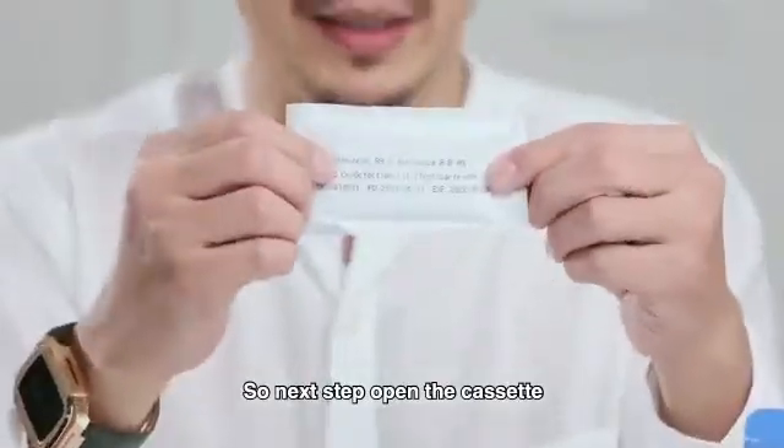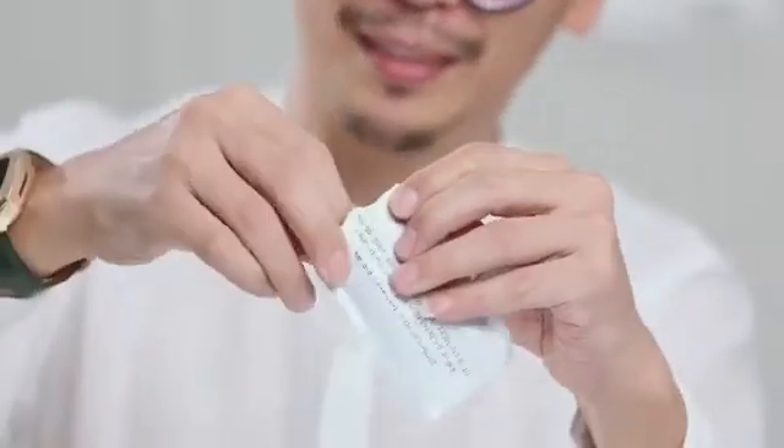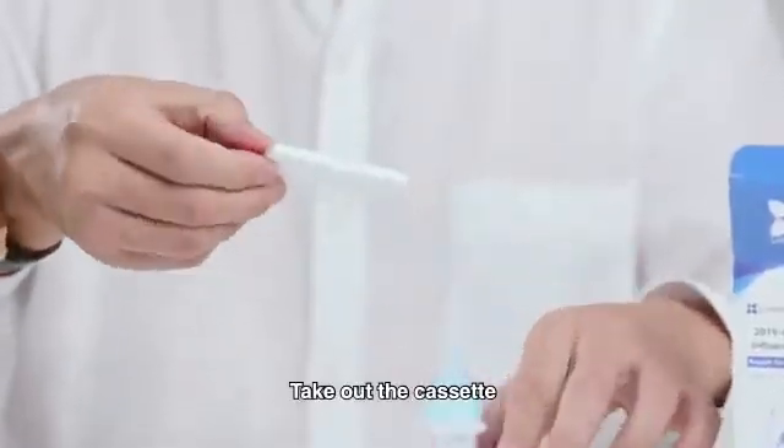So next step, open the cassette. This cassette — the expiry date is here. So just open it up and take out the cassette.